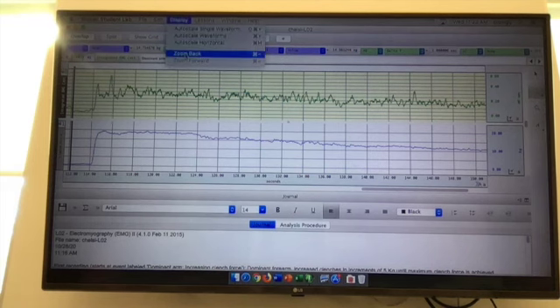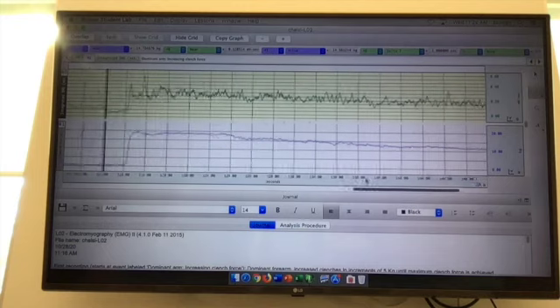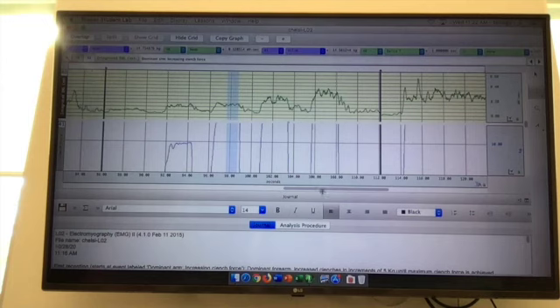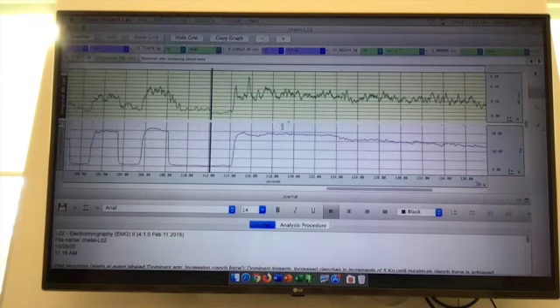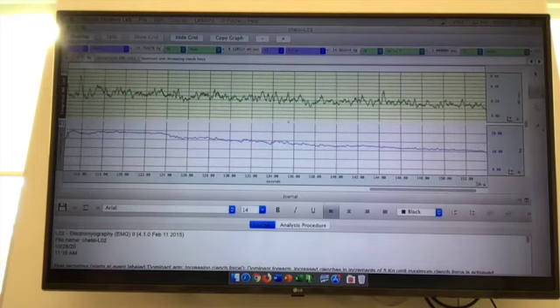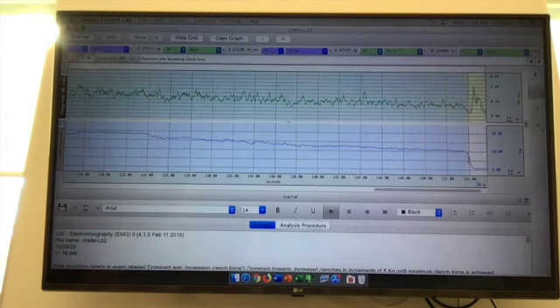So you can zoom back a little bit. If you go to display, zoom back. And we'll zoom out a little bit more. And again, you can just do auto scale waveforms to be able to view that. And I'm just going to highlight this entire section.